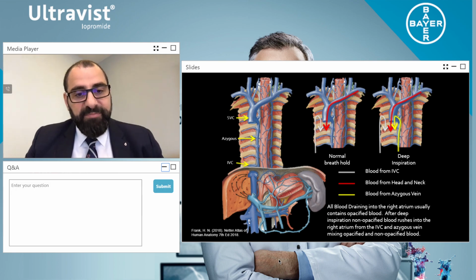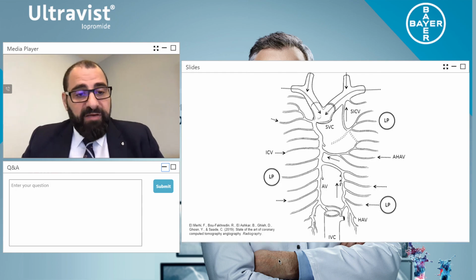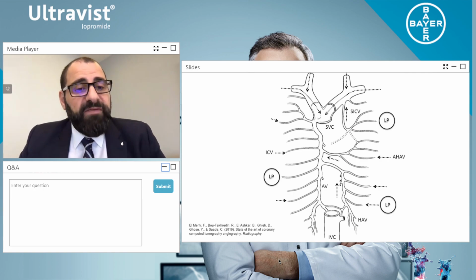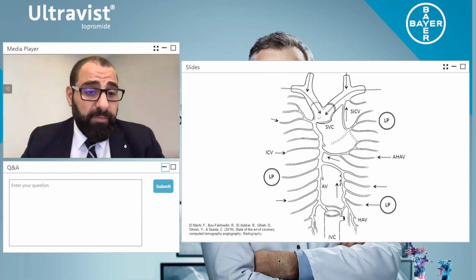Well, I'll tell you in a second, because I want to show you now anatomically what happens even more, because now I want to explain it. So if we have a look here at your image, the superior vena cava is receiving blood from the right and left brachiocephalic vein going to the superior vena cava. It then will flow into the right atrium. Now, you know that the intrathoracic veins, they're at a low blood pressure, okay? And then your azygos vein is also at low blood pressure. So everything at low pressure is moving in very slowly. So the contrast coming in can do it perfectly.